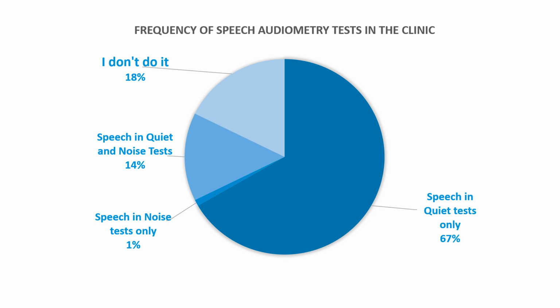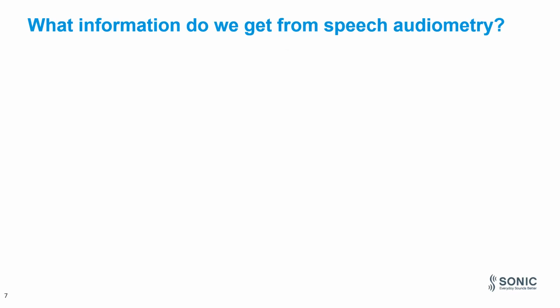For me, this is really amazing, and I really want to applaud you guys for seeing the importance of doing speech audiometry in your clinic. So keep it up. Let's talk about speech audiometry. And when I say speech audiometry, it's a general term used to describe a collection of tests using speech as a stimulus.